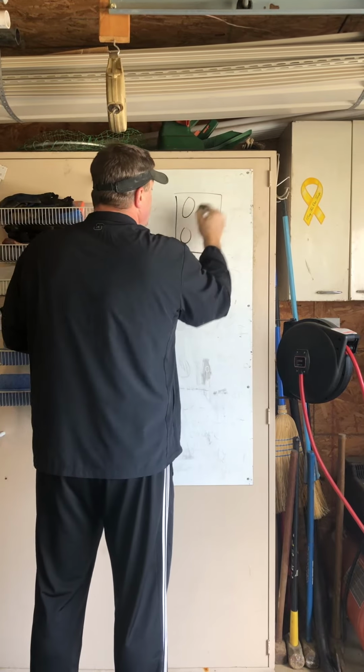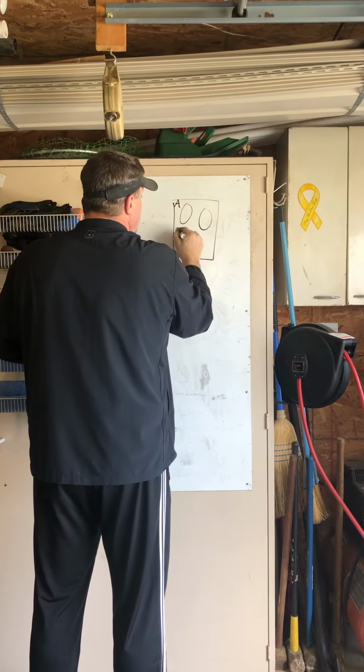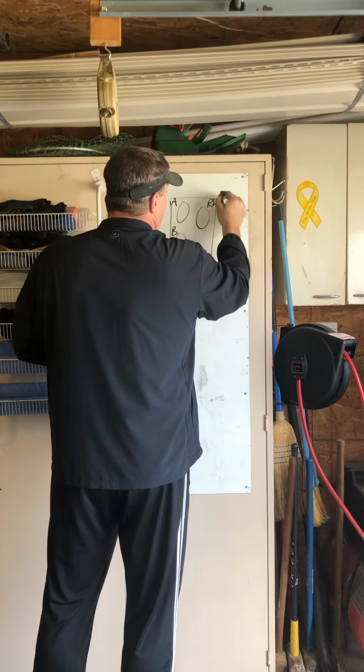you have 3 slots. This one's labeled A, this one's labeled B, this one's labeled RH. Well, what the heck is RH? We haven't talked about that. Well, for example, if I have an A blood type, which we just showed you with that A flag, RH is another antigen that can be present or it's not present. If it is present, we would call this A positive blood. If it is not present, it would be A negative. So RH is the positive or negative in blood types. It's either present or it's not, and it's just another antigen.